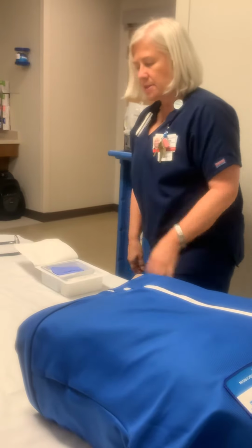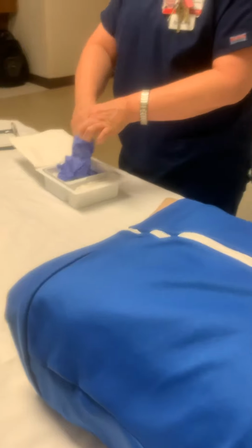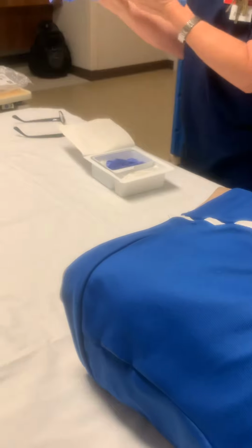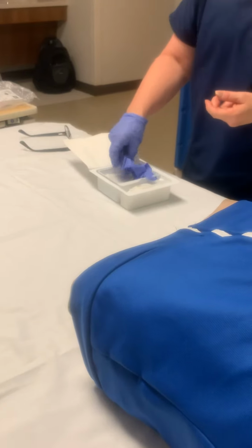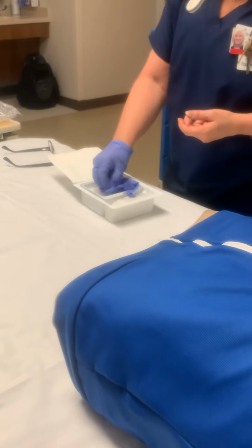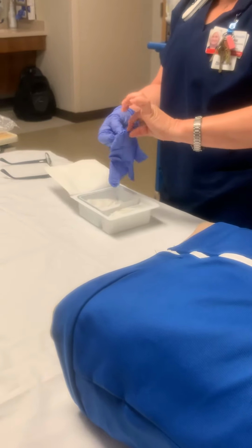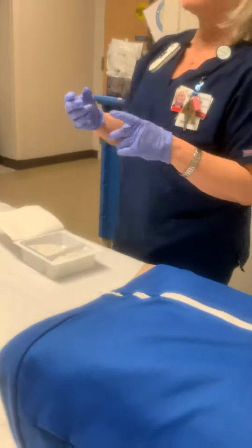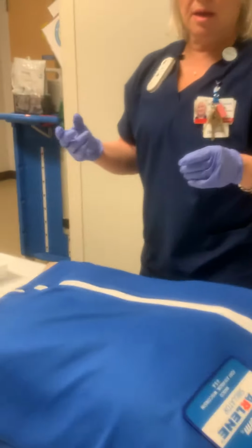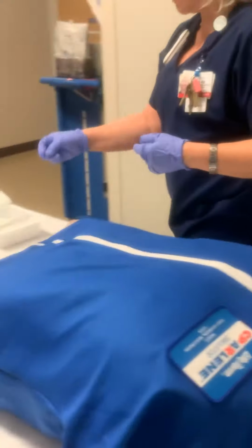Absolutely. So, same thing, you're going to have a couple of gloves here. You want your saline out. And I always have someone put saline in for me. Do y'all ever clean trachs much? Not too much. The important thing is they have to stay clean because of the crust that builds up, and the other thing you're going to deal with is that the inner cannula can get pretty messy.